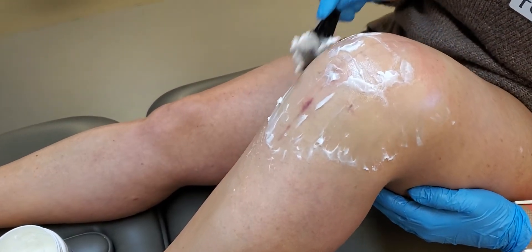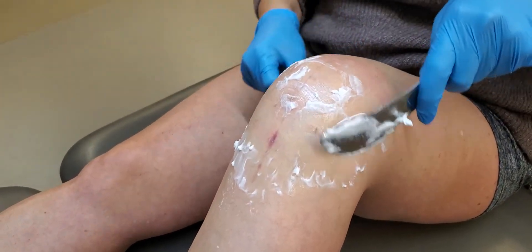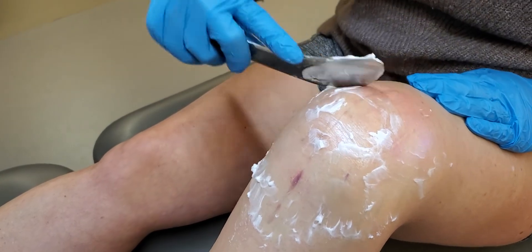The significance of that is that we know the myofascial system is multi-layered, and it's the gliding of the superficial versus the deep layers that allows for optimal excursion.